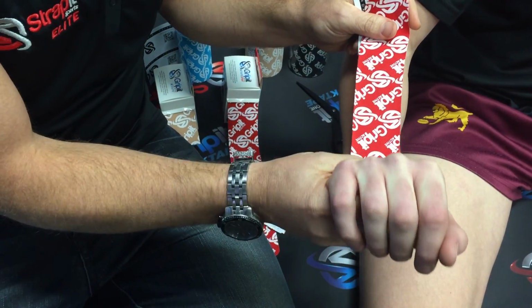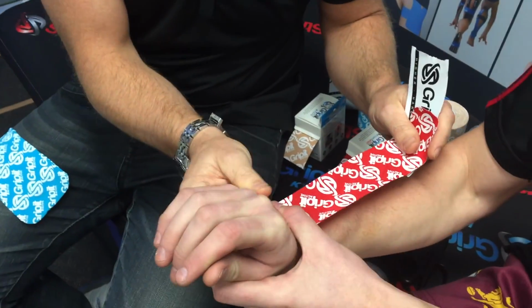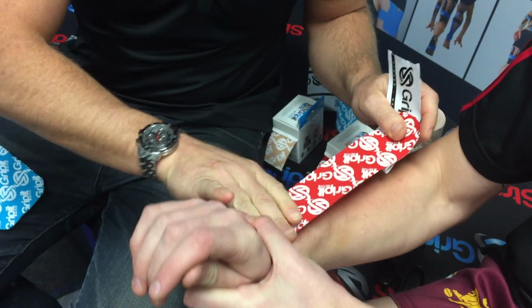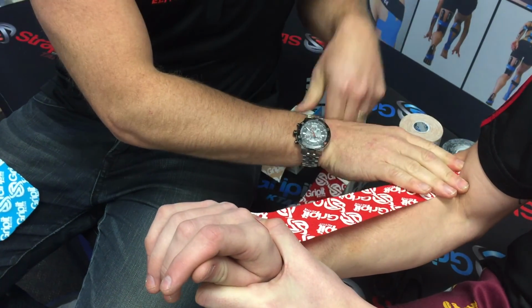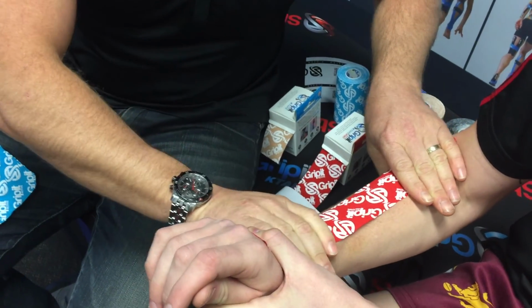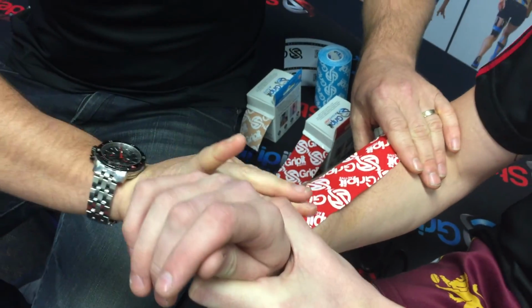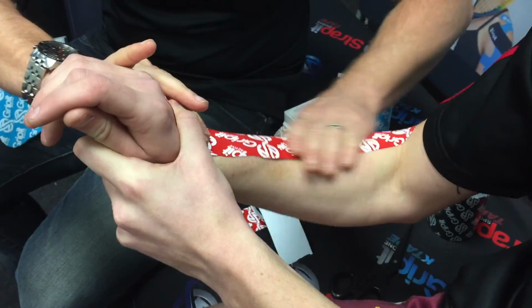So I generally ask the athlete or patient to put their wrist into extension. Yep, that's right. And then Daniel holds that, and then you extend the tape. So Daniel, we extend the tape here, get a real good pull of the tape. You'll see effectively this bow here, this area is under massive tension, and you lay that down. So that's one way we can do this taping technique. And then from there, I just ask Daniel to hold that position.